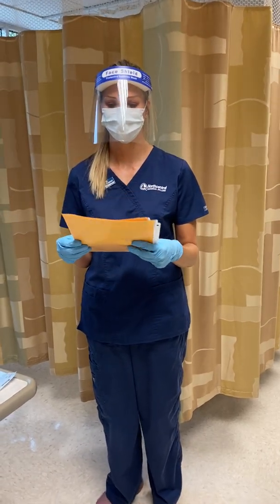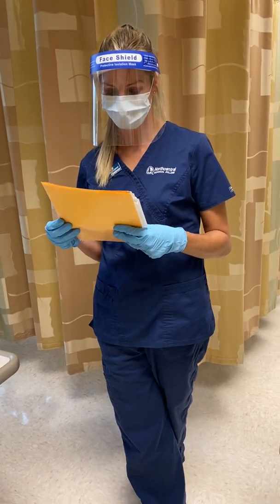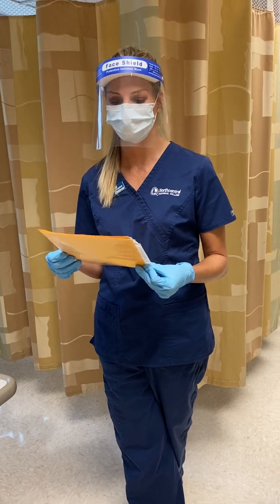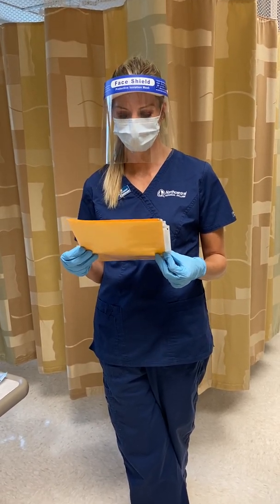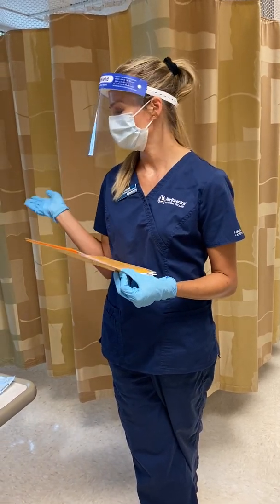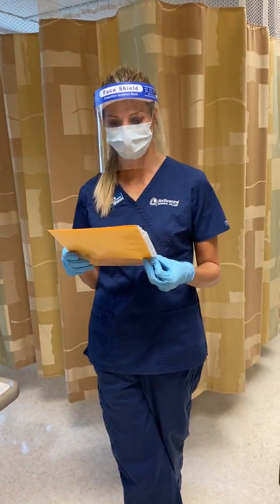Okay, all right, so I have Jane Dickinson for scenario. You're taking care of a client with a bowel obstruction. She also has a central line in place, and she'll be receiving chemotherapy. We've got 0.9 normal saline solution running right now at TKO, and she's currently complaining of severe nausea.